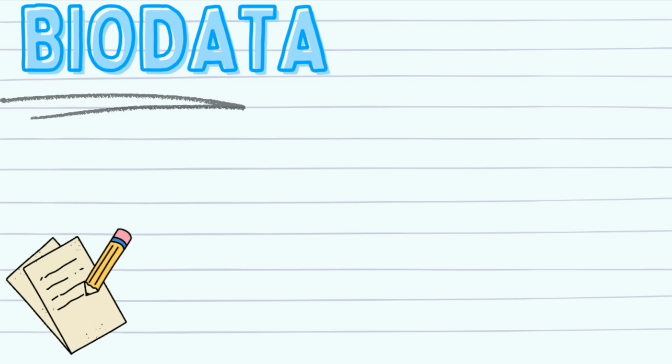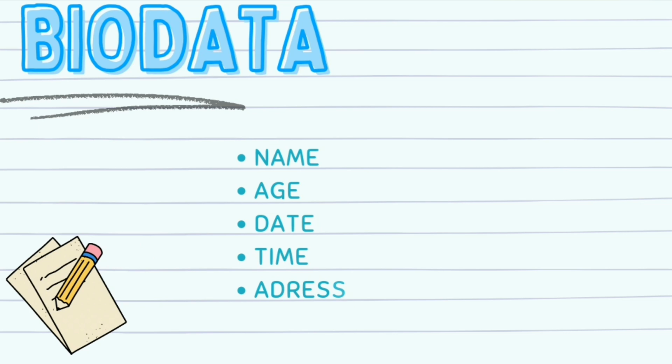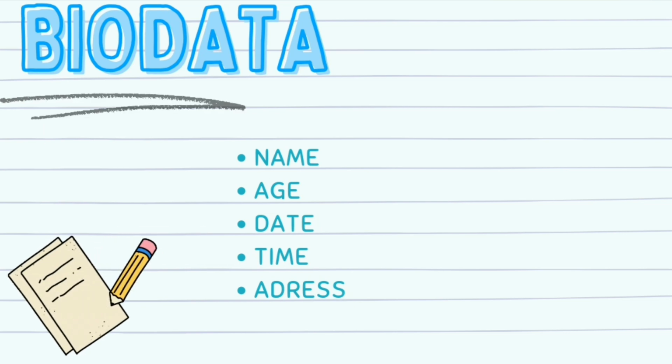Biodata. Includes patient's name, age, address, date, and time of ECG. These are important for identification of the right patient.